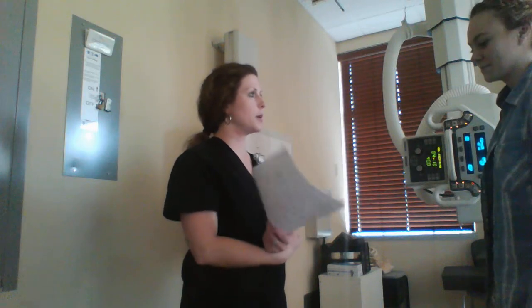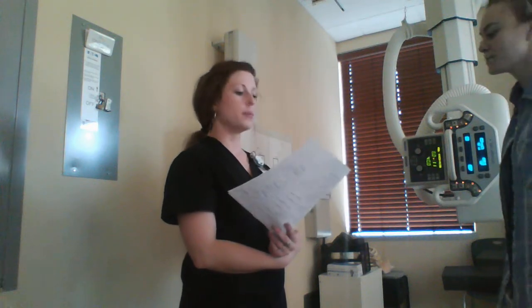Mikayla? Yeah. Hi, I'm Chelsea. I'm going to take some x-rays of you today. Can you just verify your name and date of birth for me? It's Mikayla Cominger and I'm born in 94. Perfect.